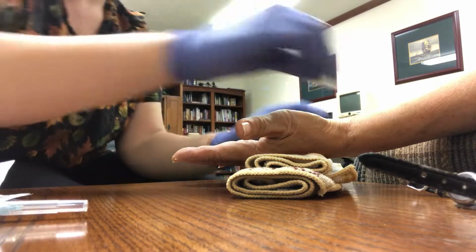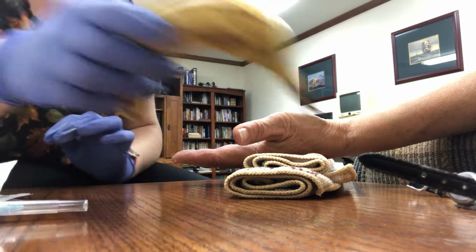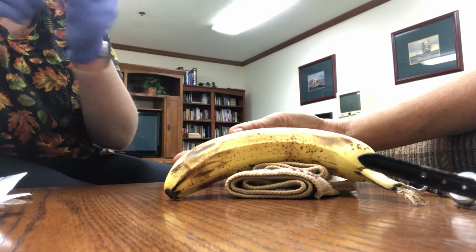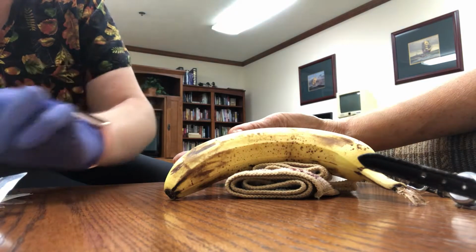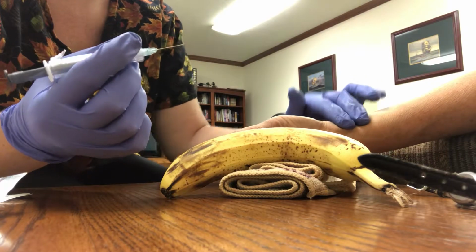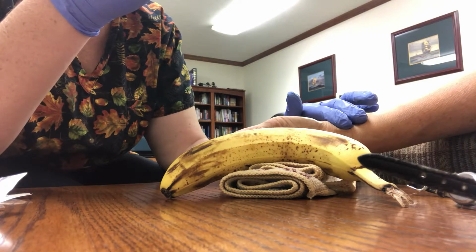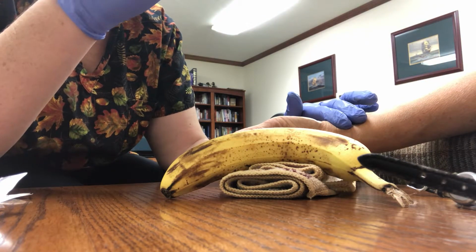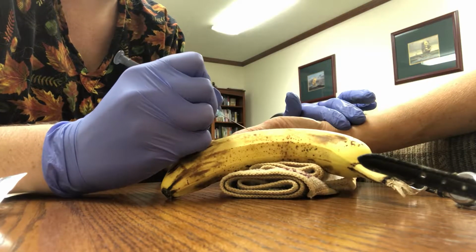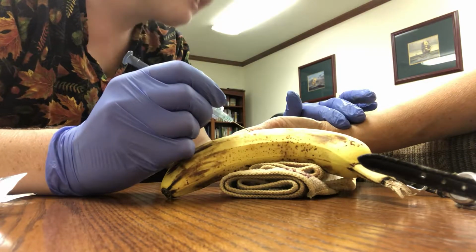Okay. So I'll go ahead and real quickly clean this area again and clean my gloves. Okay, and then go ahead and take the cap off my needle here. Okay, and then I'm going to feel for your pulse. Okay, right there, you have a really strong pulse. So bevel side up on my needle. I'm going to draw back to the amount of blood that I need. Okay, and then at a 45-degree angle, okay, you're going to feel a poke. Okay, and then got blood flowing in, so I hit your artery.